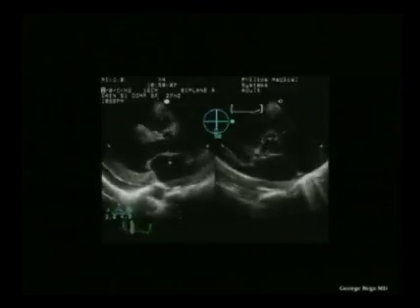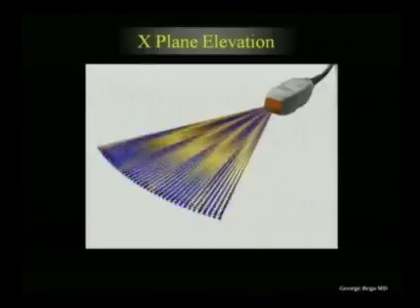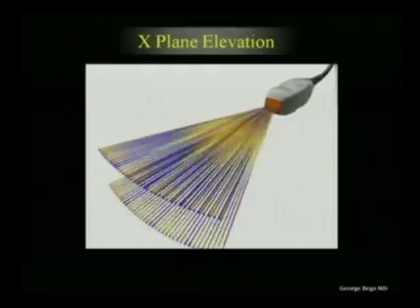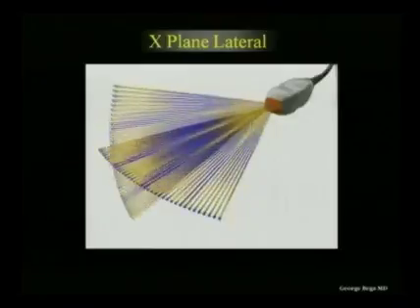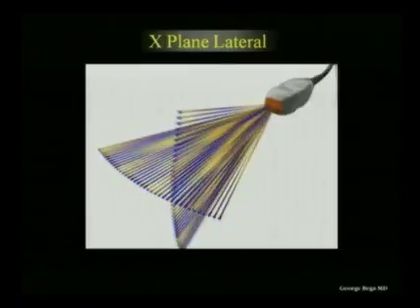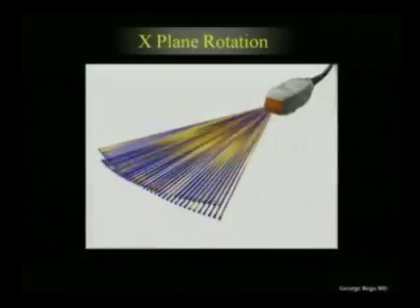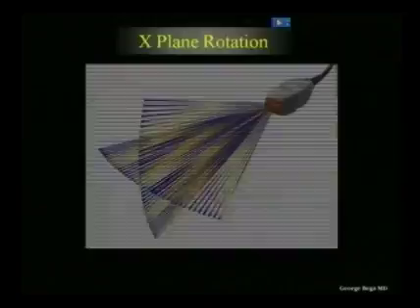But important here to understand is that two orthogonal images can be simultaneously displayed and in focus. Of course, these images can also be tilted up and down, or left and right. So you can have more than one image plane scanning. One stationary, the other can be moving. It can be up and down, or left and right, or in rotation. So also you can rotate this image plane at any angle and at any point in this aperture level.